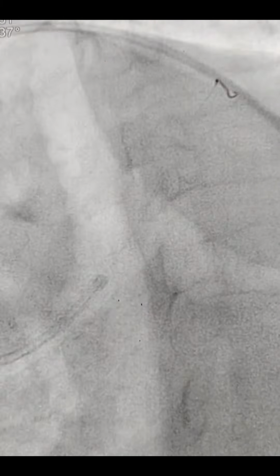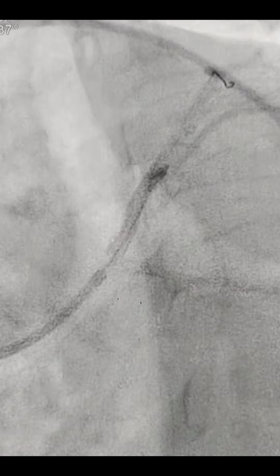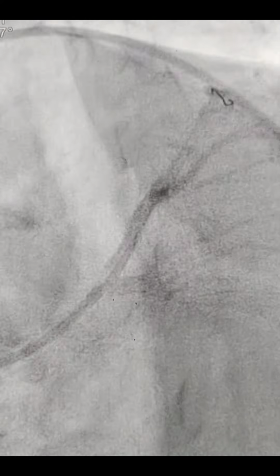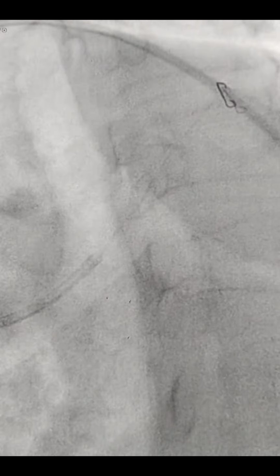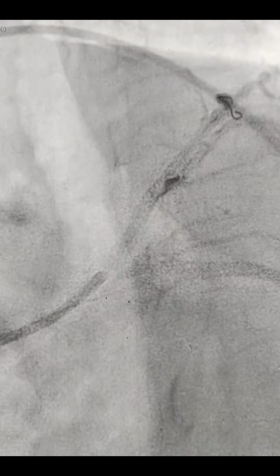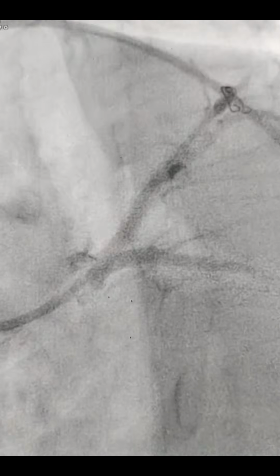Nominal was 10, RBP was 16. So deployed. And this is the picture after deployment. We wanted to do the NC for this patient. The stent is well expanded, but as this is ostial and proximal LAD, we always do the NC for this patient. So we did the NC.